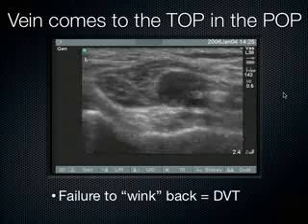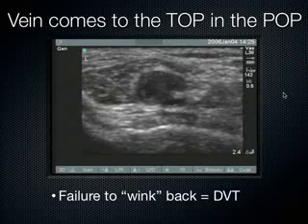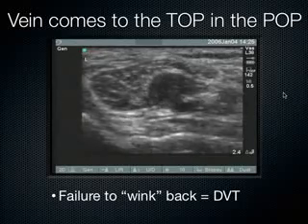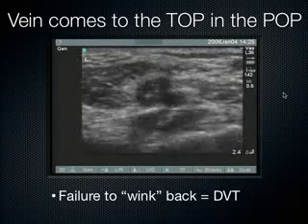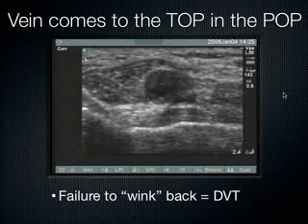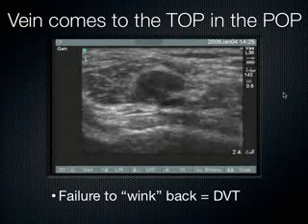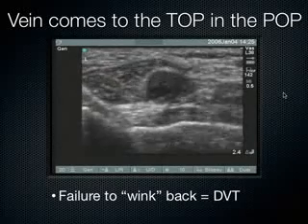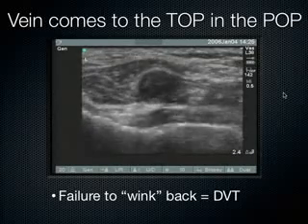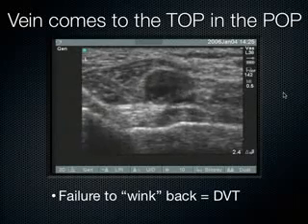Okay, the other thing is, if you come across a DVT while you're scanning, at that point, record it, and we'll get more into how to record with the machine later. But it's not the time to start showing everybody this and compressing it over and over again, because you could potentially dislodge the clot and mobilize it to a pulmonary embolism. So that's why it looks like I keep compressing it, but it's just the video looping around here. So for teaching purposes, once you uncover this, make sure you just grab it on video and then show it to somebody right away.